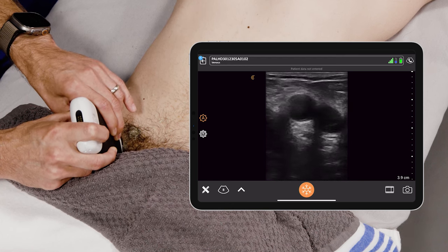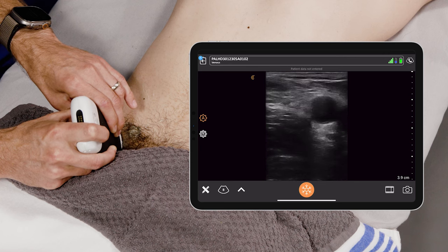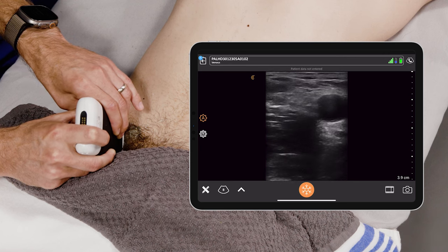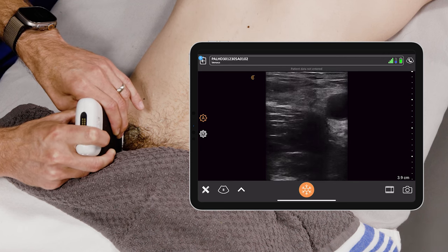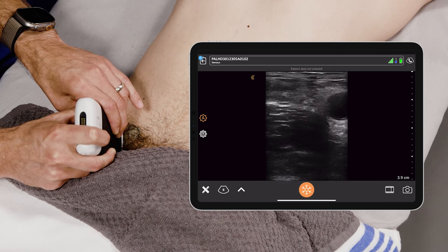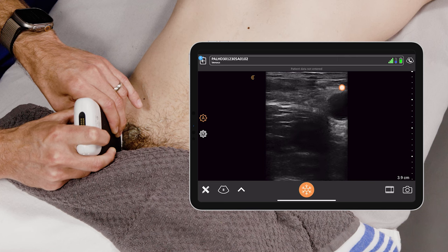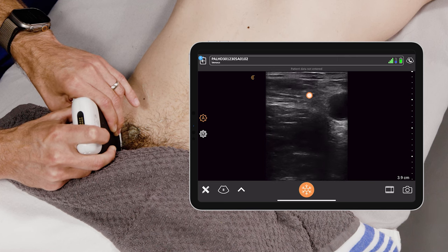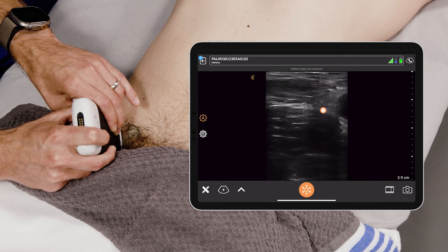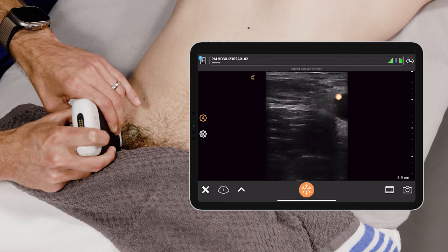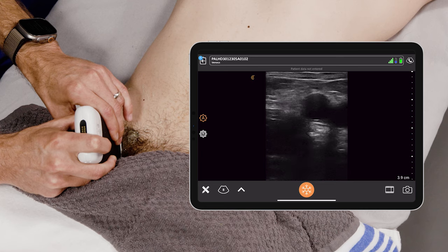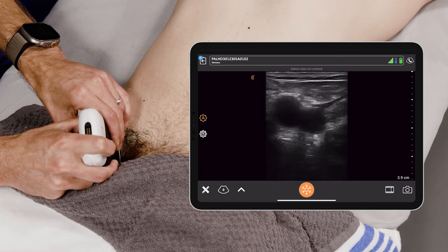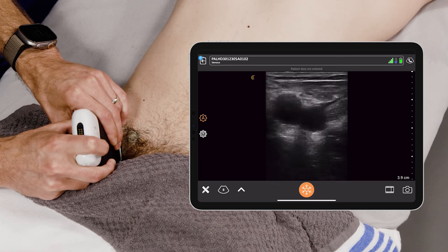Also, if you slide laterally, you'll be able to see this nice triangular structure that fits just below the fascia iliaca — and that is our femoral nerve. So nerve, artery, and then vein.